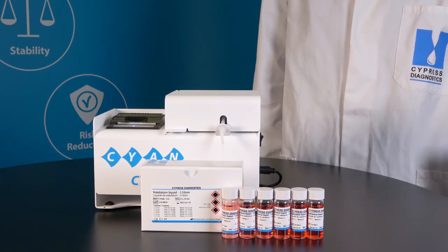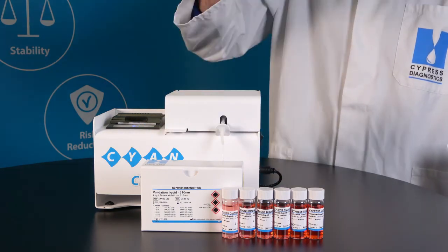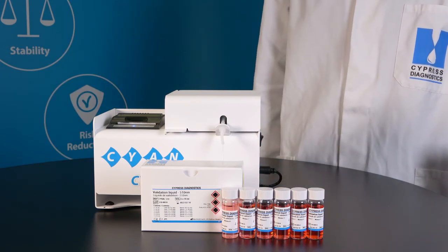In this video we will execute an optical validation of a biochemistry analyzer using our validation solutions. To perform the verification, take the reagent out of the fridge and let it reach room temperature. The liquid volume is sufficient for the validation of one analyzer.